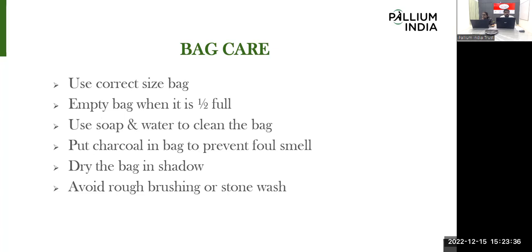Then we can clean and reuse the bag, so we need to educate them to use soap and water to clean the bag. To avoid the foul smell in the bag, we can educate them to put some charcoal pieces inside the bag. It will prevent the foul smell because of its antioxidant activity.